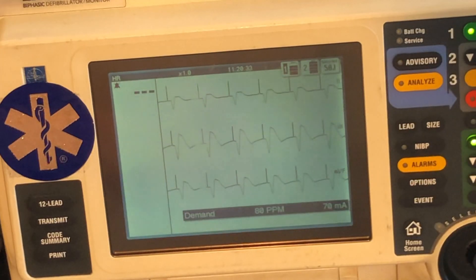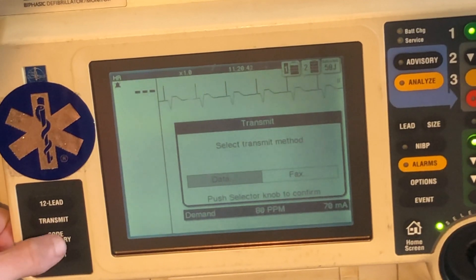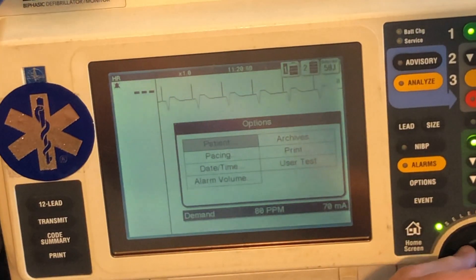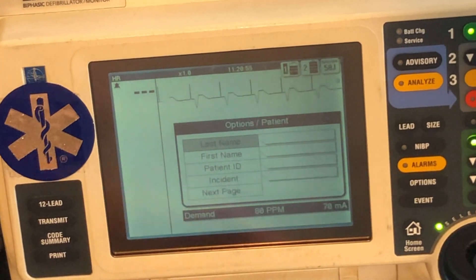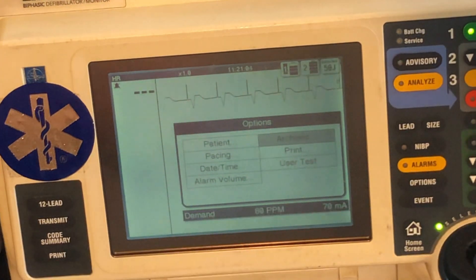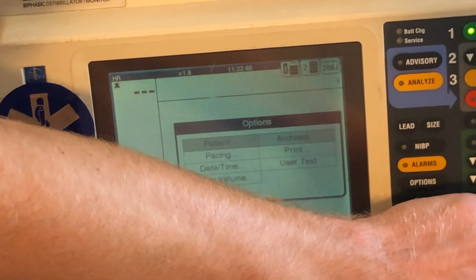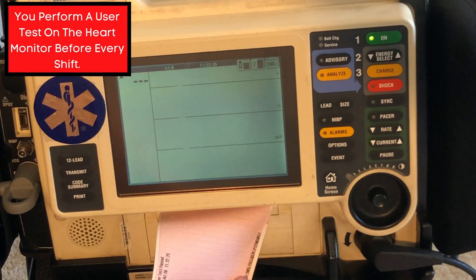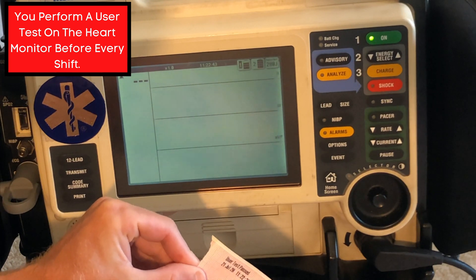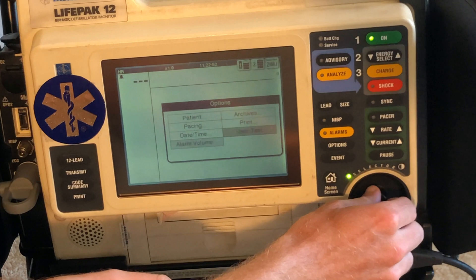There is how we do our pacer. Next, over here you can actually transmit an EKG — you can send it to whoever you want using the transmit method. A code summary prints out a summary of everything that we've done. Some other things you may not know about: the options button shows options for patient information. The archives will show you former patients. You're also going to go to options and always do what they call a user test on the heart monitor. What gets printed out is a user test — it'll say pass or fail. It's passed here, and you can see today's date and time — that shows your LifePack is in good working order.